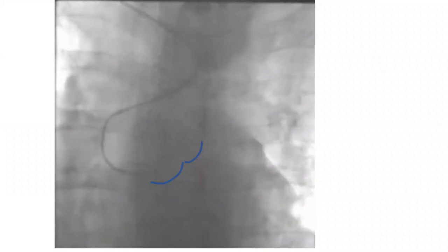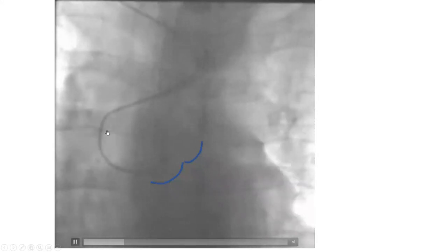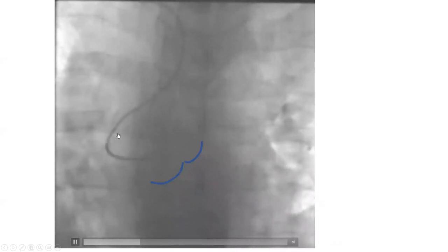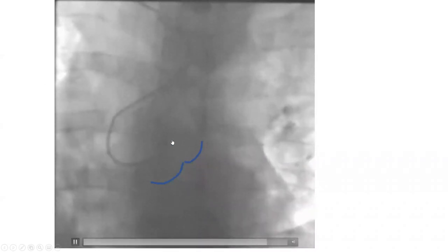Now we decided to intervene on the same patient. So I had to redo this using an Ikari left. I did the same thing — look at that nice plate in the Ikari left that sits on the opposite aorta and gives you good support, unlike the CLS-EBU system. I used Ikari left 3.75 and pushed from the right cusp. A puff showed a ridge — I was still in the right cusp — but I kept pushing from the right cusp and was able to engage the left coronary. I did not pull and jump because the catheter would prolapse every time.